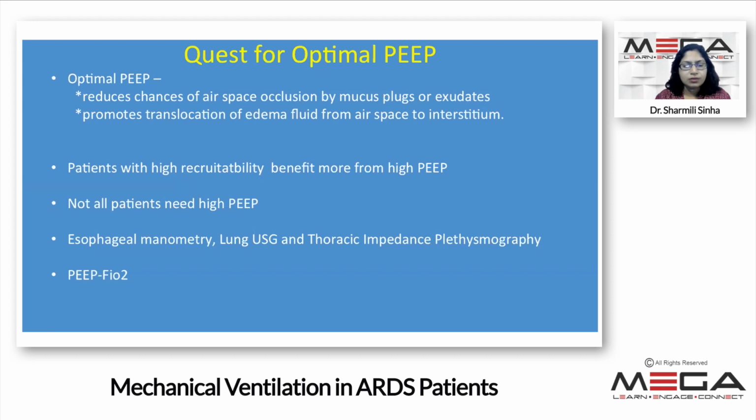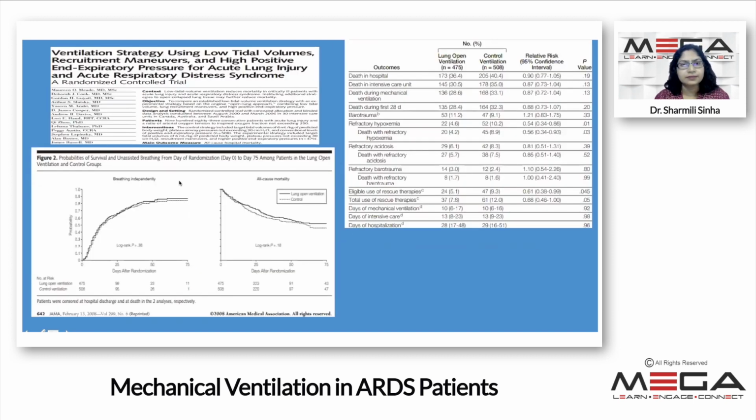We do not always need these higher modalities or technology to assess recruitability and patient behavior. And as my previous speaker mentioned, the best way to learn and handle the ventilator is to be by the patient bedside and work with it. There is a PEEP and FiO2 chart as per the ARDSNet protocol that you can always see as a rough guide.